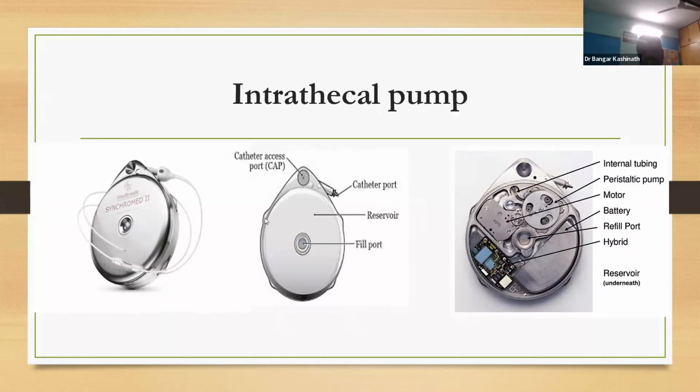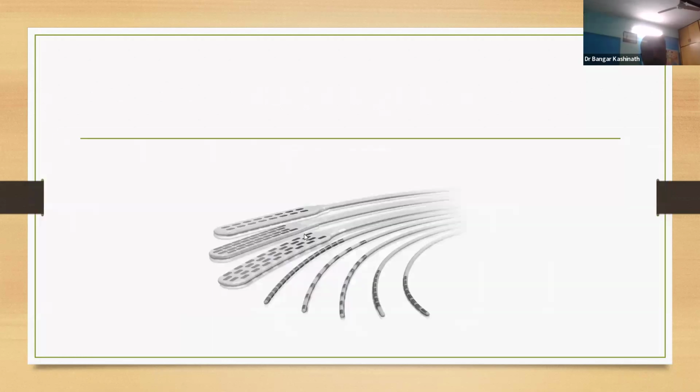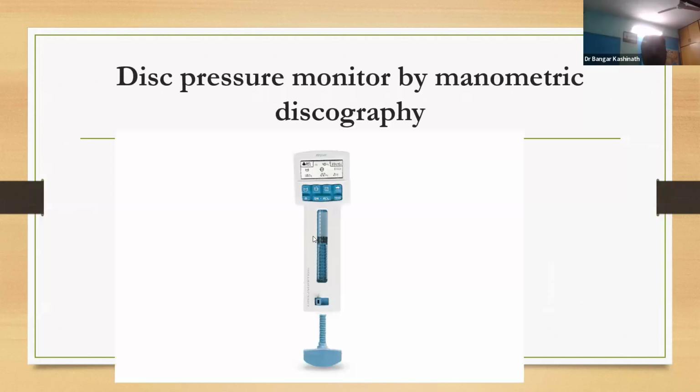Okay. Various indications, contraindications, side effects. There's a possibility that you might not have seen this. Okay. There will be a disc pressure monitor for discography. It will look like this. You should know what is a provocative discography, what are the different pressures and methods.